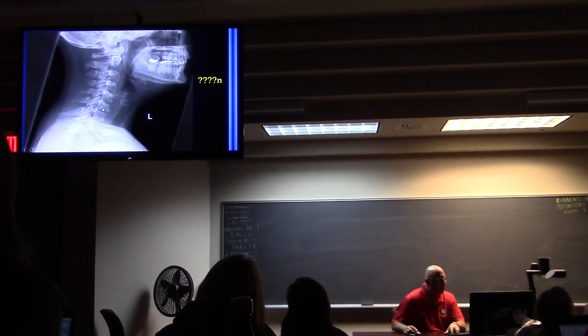You see the fracture at 6? Right there. That whole vertebral body's been fractured.